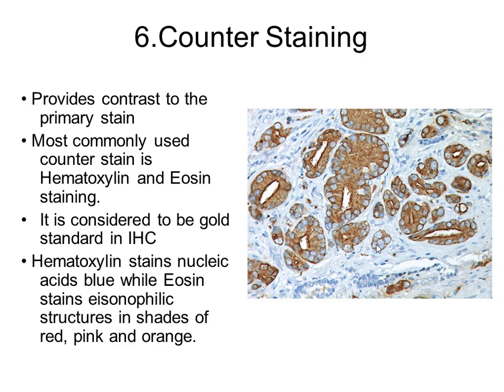So we can see the brown color immunohistochemical reaction products on the base of the pale blue tissue. The nucleus is more bluish than the other tissue.